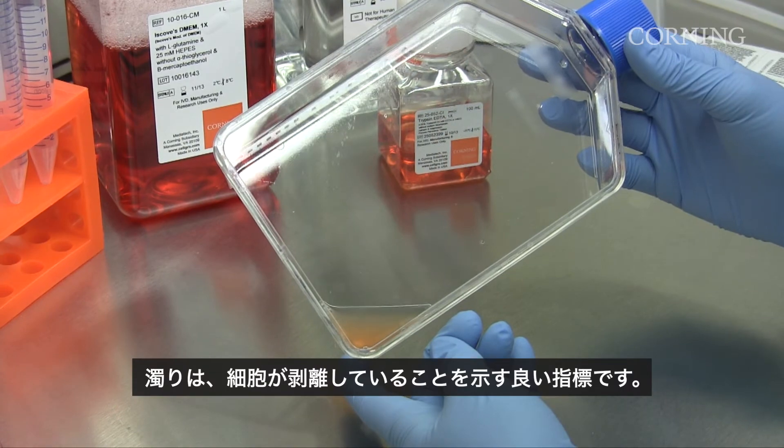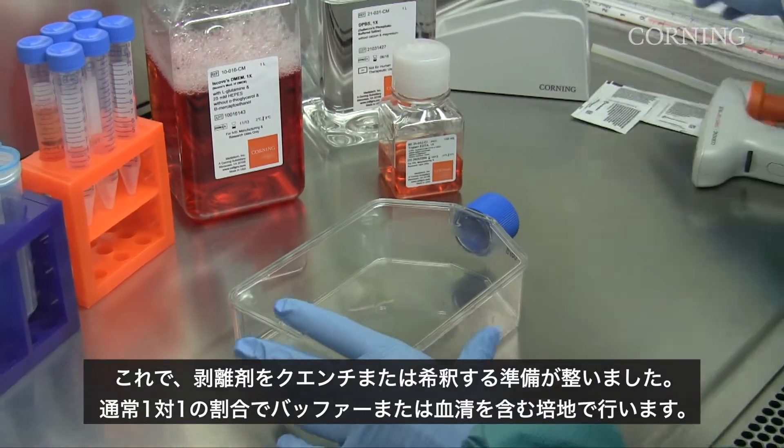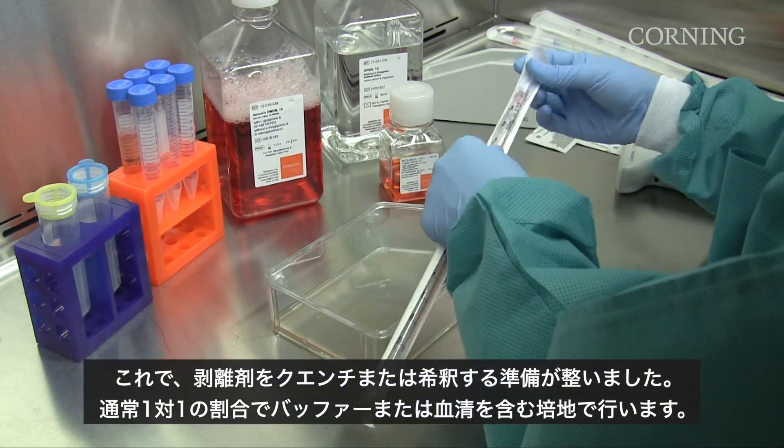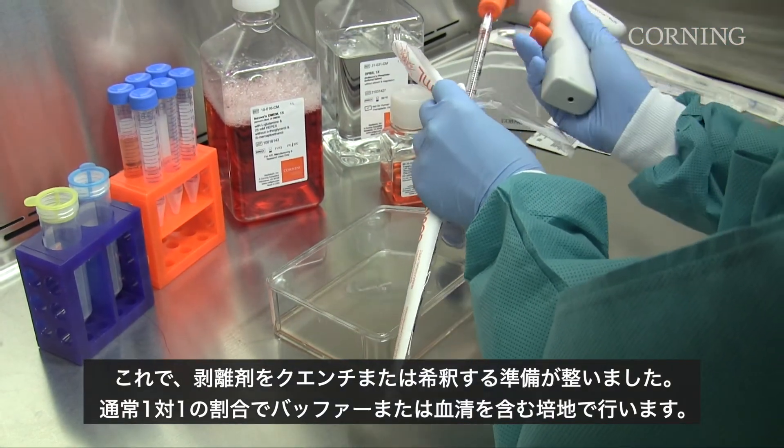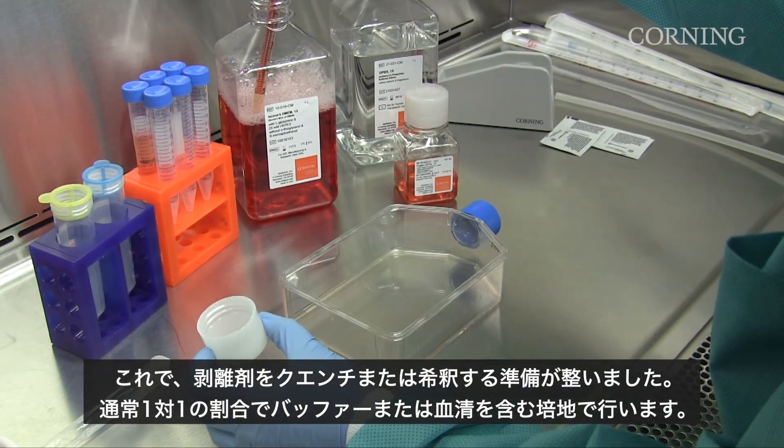Turbidity is a good indicator that the cells have detached, so now we are ready to quench or dilute the dissociation reagent, usually in a ratio of 1 to 1, with either your buffer solution or media containing serum.